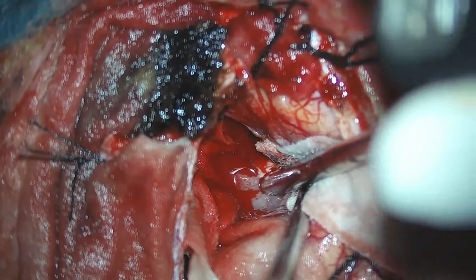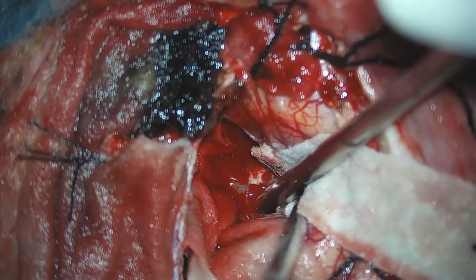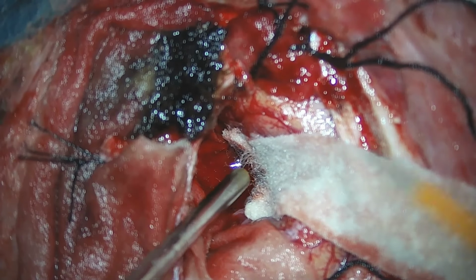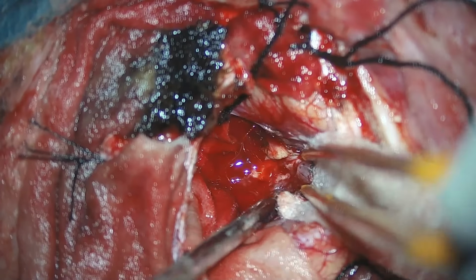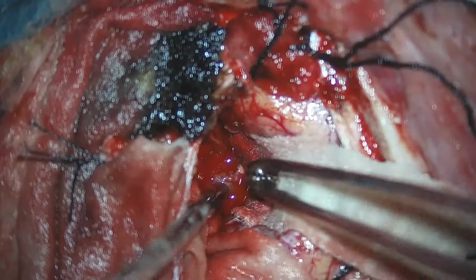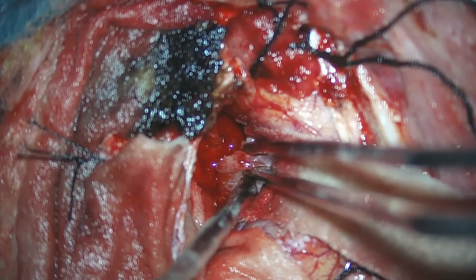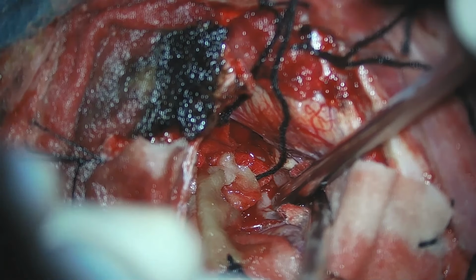So the debrider is being kept and the debulking is being done, and any amount of blood that is coming has to be aspirated and has to be stopped. Hemostasis is of utmost importance as it creates difficulties in creating the plane. Again, we are using the debrider here and slowly debulking the tumor bit by bit.